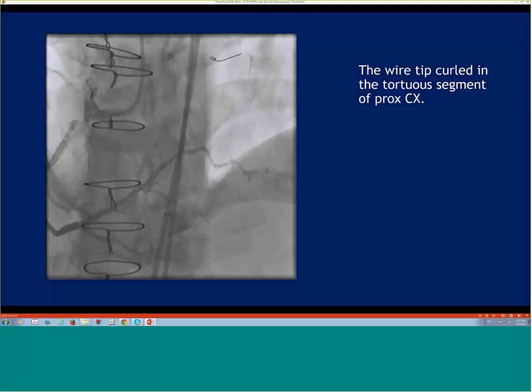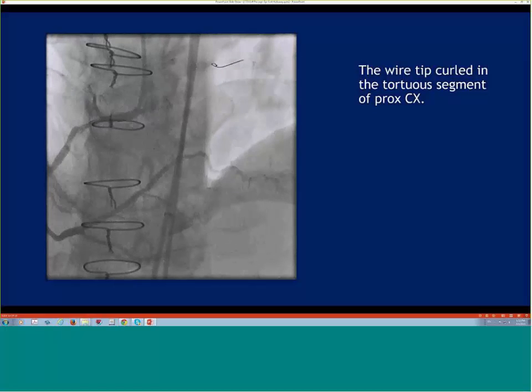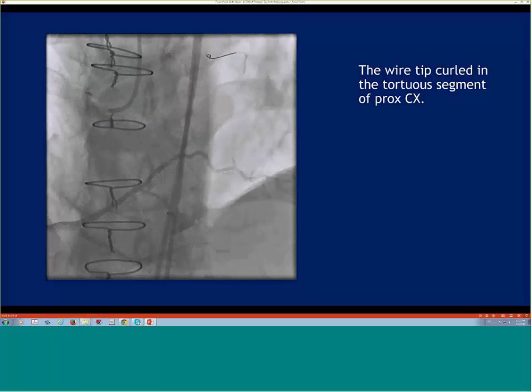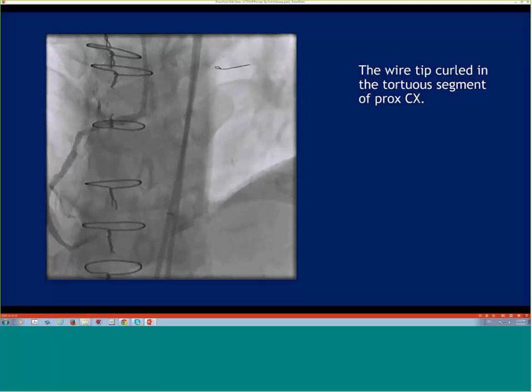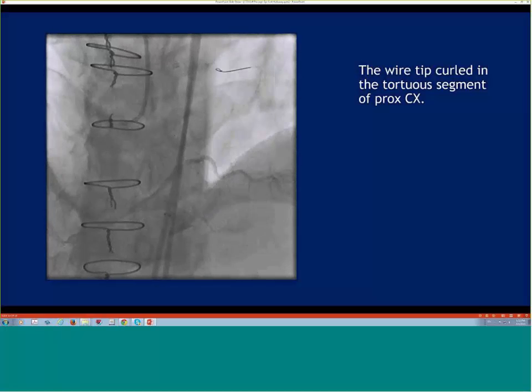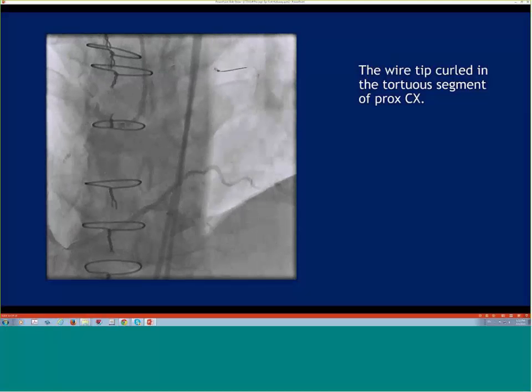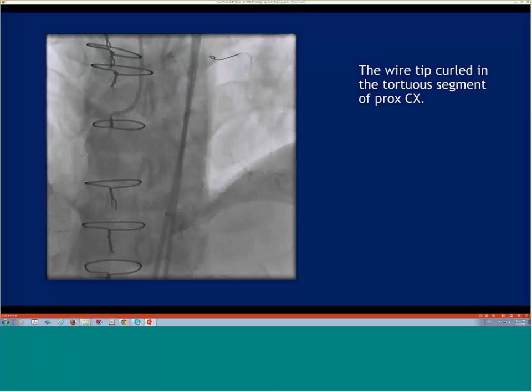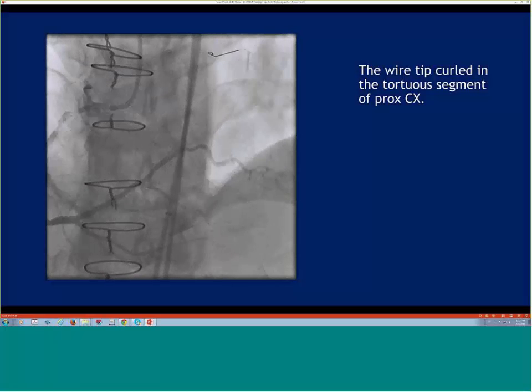Again, in this case, given what you've seen so far, and I may be wrong, I think the proximal cap is much more proximal in the left main, if I understand the picture correctly. You went to the collateral once, so that should not be as big of an issue, but one way to approach this time is to go with 8 French if you can on both sides. Or if access is an issue, maybe go radial 8 French, or put a sheathless 7.5 French radial, or anyway go big.